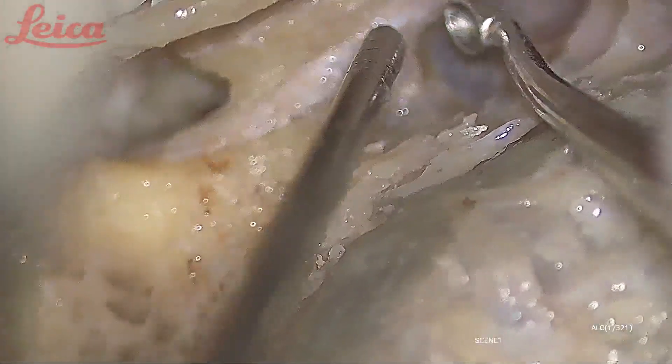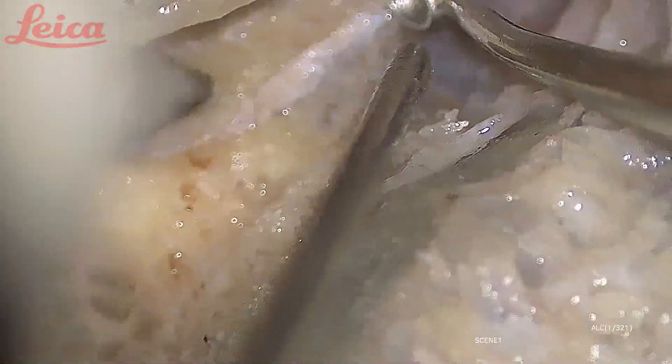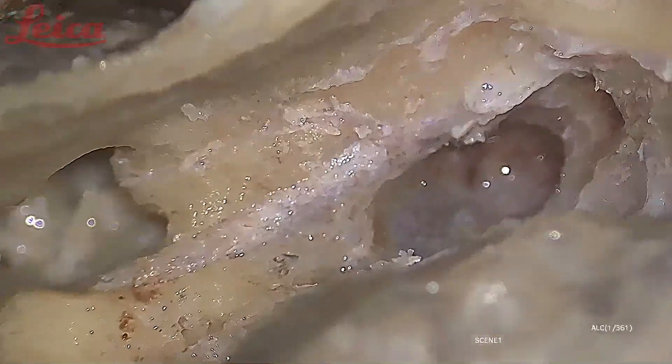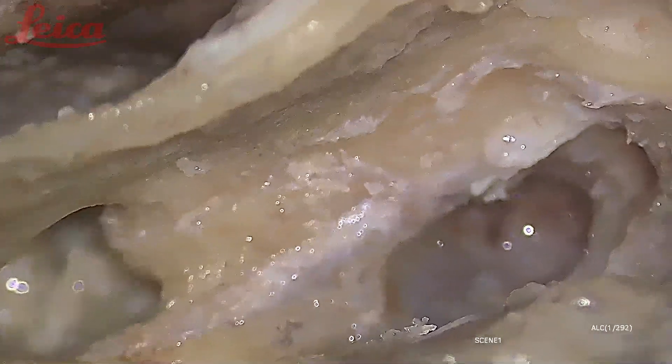Here you can see the chorda-facial angle very clearly now. The chorda tympani is taking origin here.